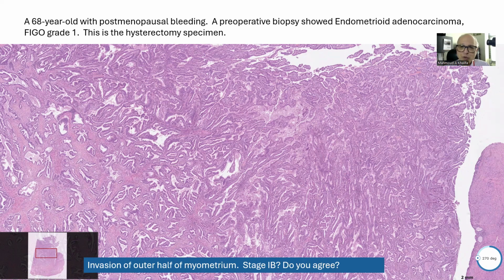This pattern could be problematic for some pathologists who would say, how am I going to make a diagnosis of adenocarcinoma if the glands are not really preforming and they are not touching each other? I understand that, but the answer to that is that look at the stroma between the glands. The stroma is pink. It is collagenized because there is fibrosis, and that tells me that there is invasion of the stroma. So this pattern of invasion would be difficult to appreciate.